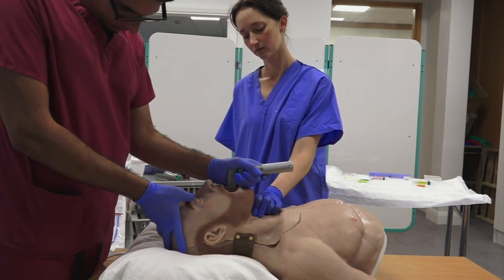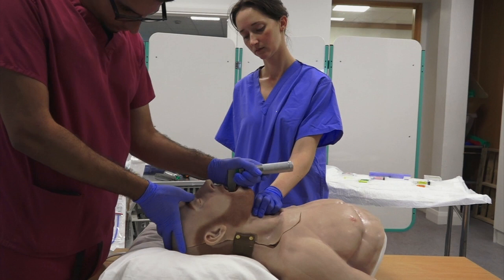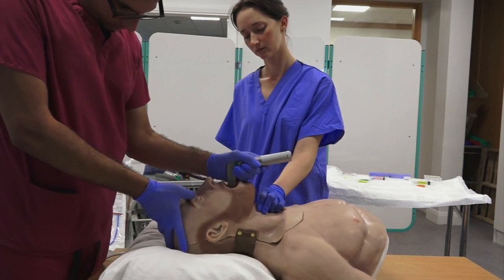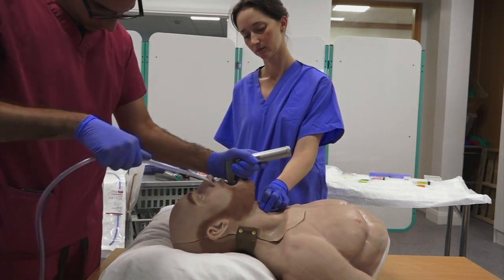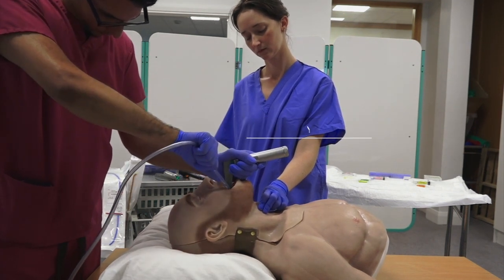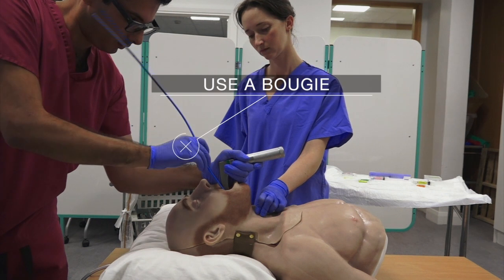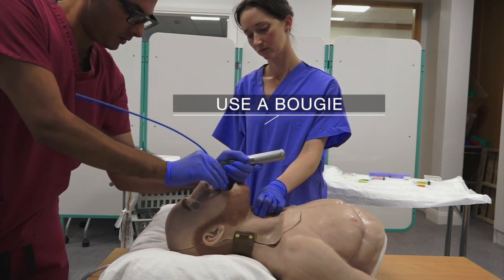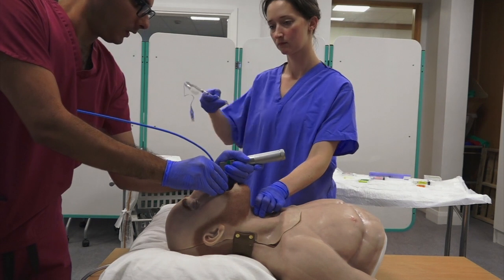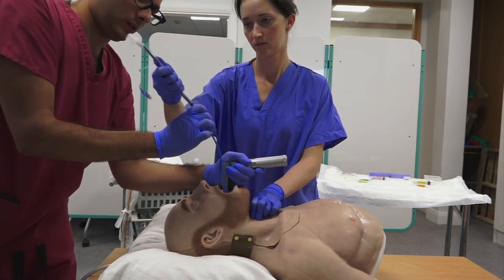Open the mouth, extend the neck, insert the laryngoscope into the oral cavity with the left hand, track the tip along the base of the tongue into the vallecula, sweep the tongue to the left, and lift the laryngoscope to reveal the vocal cords. Attempt to insert the endotracheal tube. In this case, secretions are obscuring the view of the vocal cords, so oropharyngeal suctioning is performed. As the patient has an anterior larynx, a bougie is used to railroad the endotracheal tube. For a very anterior larynx, the angle of the bougie can be exaggerated to guide the tube forwards.